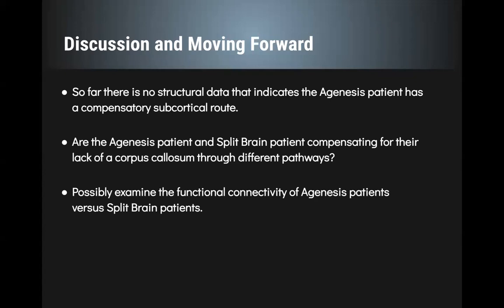This is definitely a good place to start, as far as looking at the tracks that we thought might be different. That was just the preliminary analysis. We still have a lot more control subjects to go through, but the initial data suggests that there are no elevated FA values. Yeah, that's great.